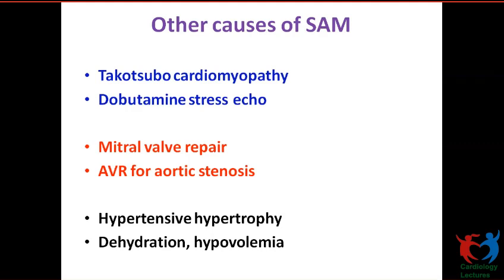Because of the excessive movement of the posterior mitral valve, at the junction of the posterobasal and the mid part there will be an eccentric hypertrophy, so the LV angiogram looks like a ballerina foot deformity.